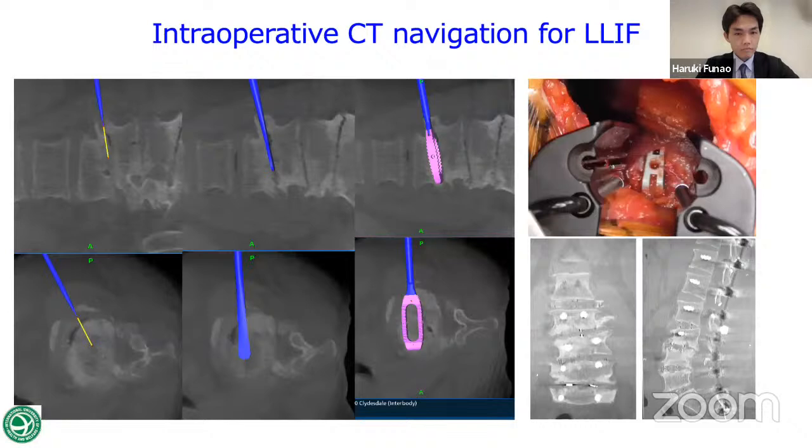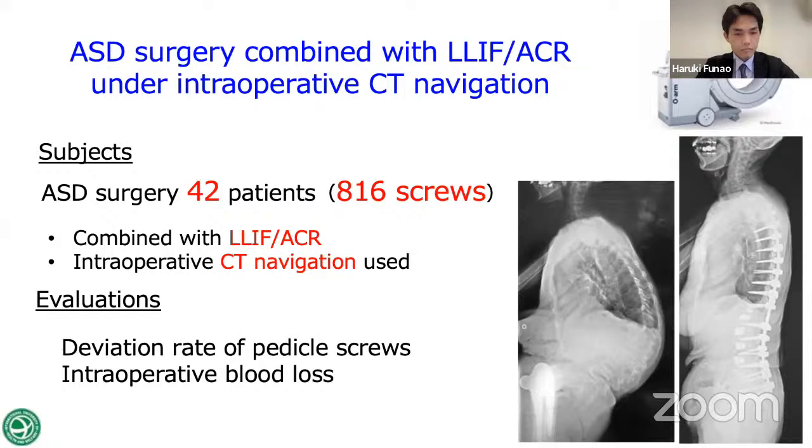We assessed the deviation rate of pedicle screw insertion and intraoperative blood loss in 42 patients with adult spinal deformity surgery. Surgery was performed combined with lateral access surgery using intraoperative CT navigation.